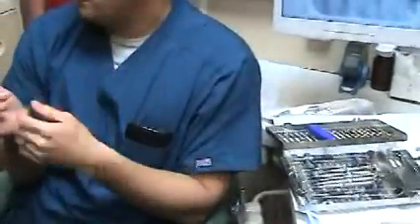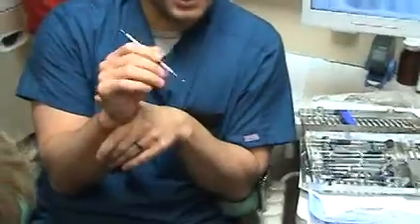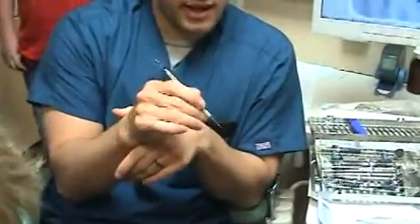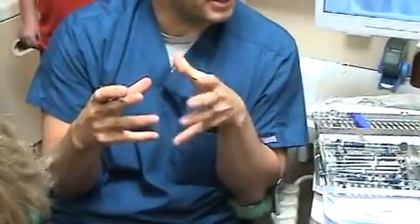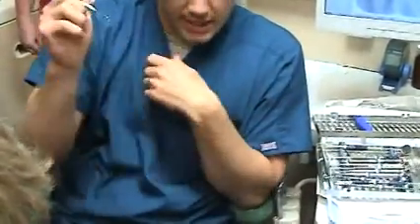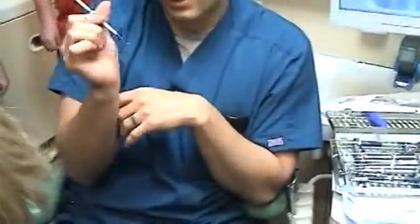But when you've got a cavity, it's going to stick. It's going to stick down in there, because that tooth structure has been demineralized and it's now cavitated. So if you ever get something that sticks in there, you've got a cavity. So that's what we use that for.